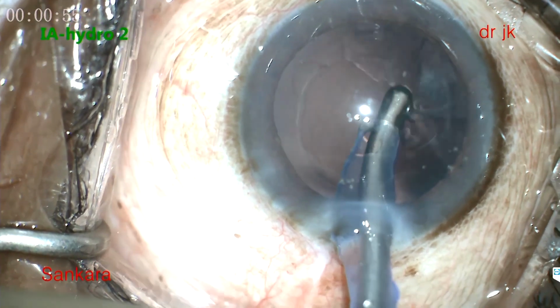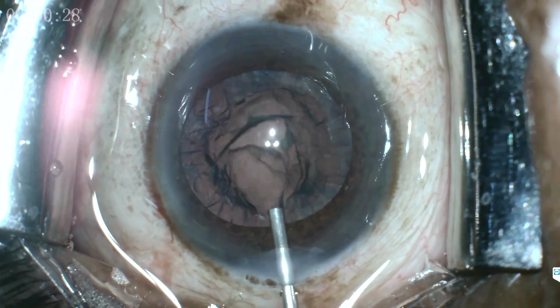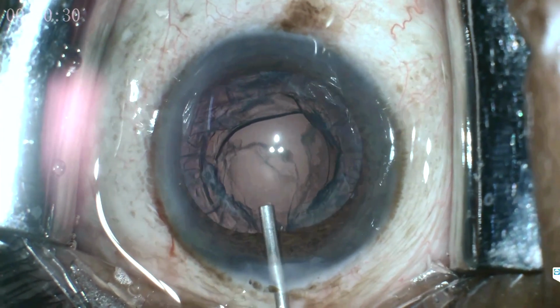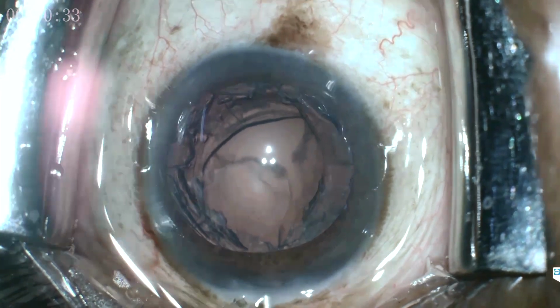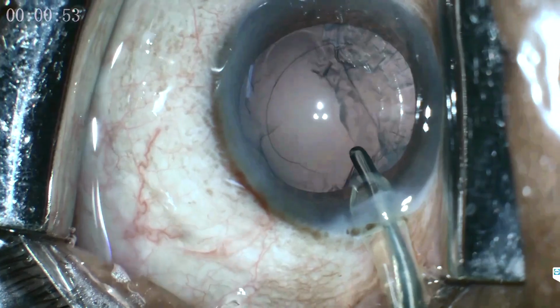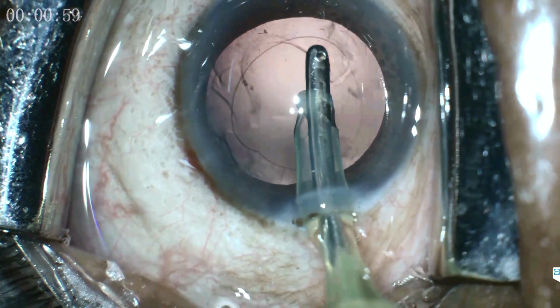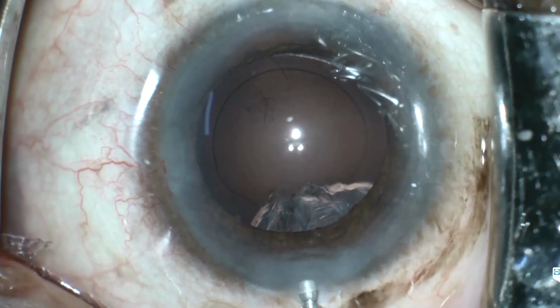It's an unedited one, no speeding, nothing, normal surgery. It takes around 15 seconds for removal of the cortex. Sometimes the posterior capsule will be bulging at the end of surgery. When you see a bulge, use a viscoelastic, generally methylcellulose, push it down and make it concave. Just don't put the probe inside, because if the face is convex you have more chance of a rent.